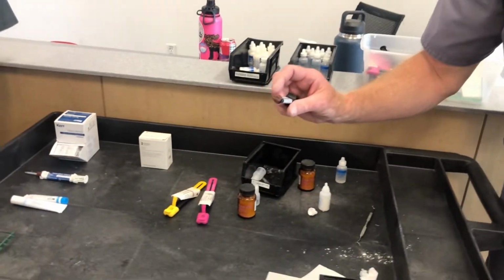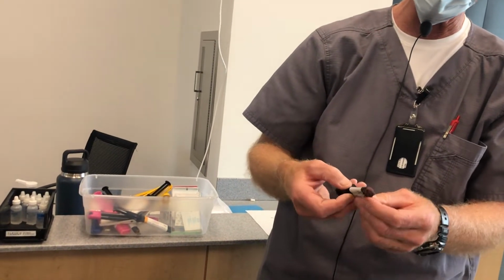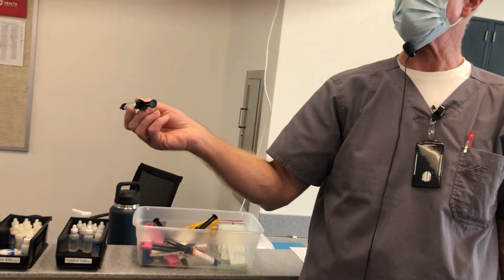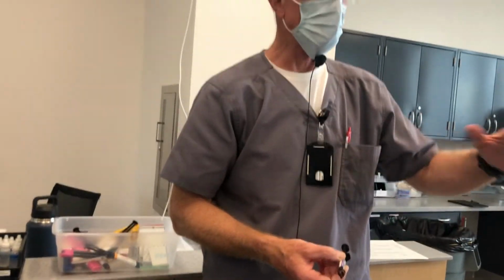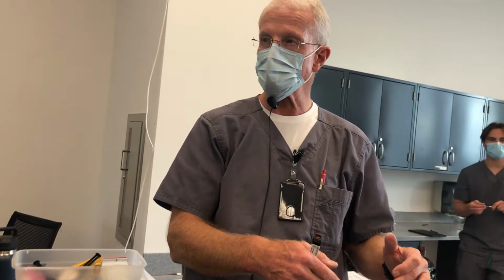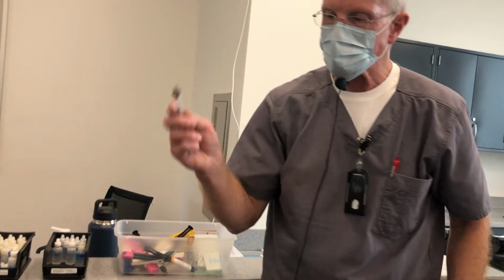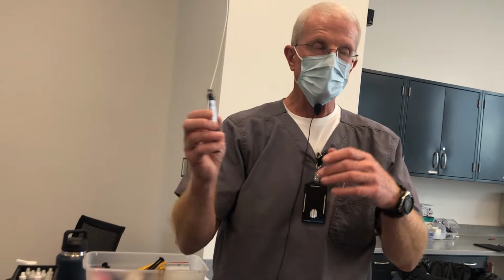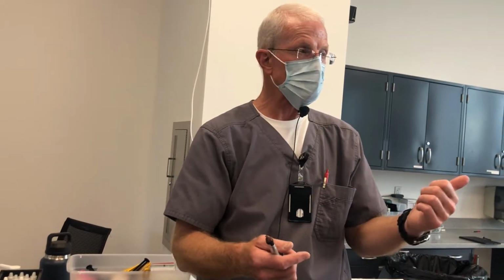Now, this is the only example of it that we have, but we have a whole set of, this one's called Calibra, and this is an aesthetic resin cement. So it's used for veneers, it's used for ceramic onlays. You can use it for crowns if the crowns are a little bit translucent. If they're not, I would stay away from this. The aesthetic resin cements can be used in light cure only mode or chemical cure only mode, although we seldom do that anymore, or dual cure mode. And that's the most common. So your buildups are a dual cure.